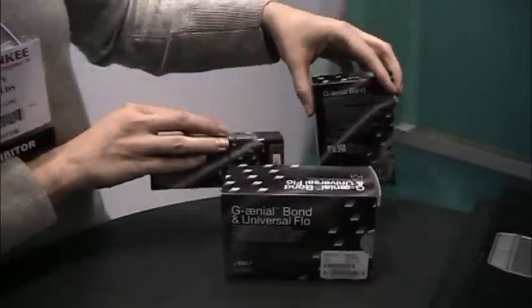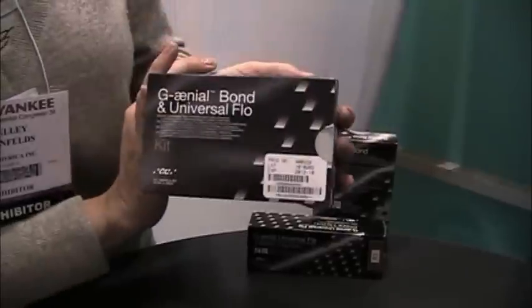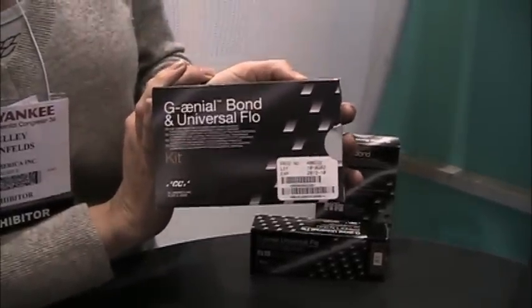So those are our two new products — Genial Bond and Genial Universal Flow — and they come together in this lovely pre-packaged kit. Definitely come to the booth in Chicago; you'll hear all about it. We look forward to seeing you there. Thank you very much.